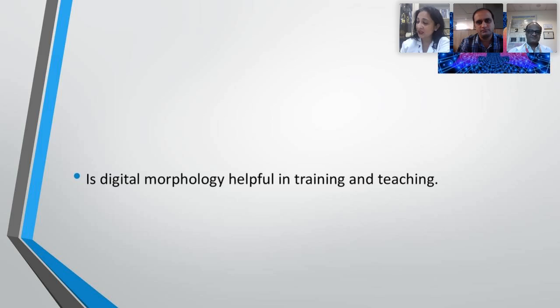A beautiful library can be created. And we can actually have a lot of other options available with that, like the Vision software, where we can go and see and have our questions ready for our staff. So that is one thing which we are planning to do very shortly. Second thing is CellaVision has an atlas, which sir, you also mentioned, which can be on your phone. You can look at the morphometry, the description of the cells, and if you are lost as to which cell is what, you can always refer back. There is a quiz attached to it. So there are multiple tools which I found are already available.